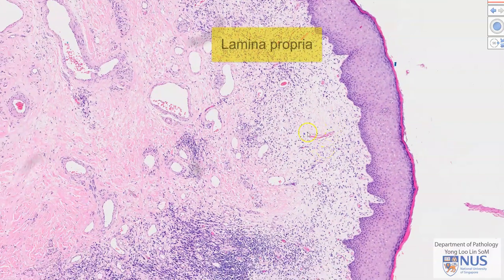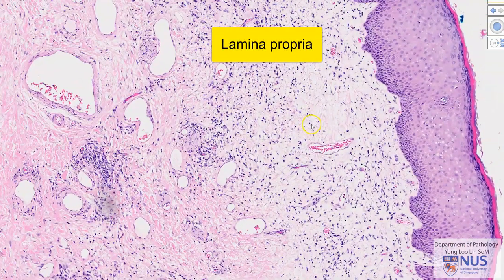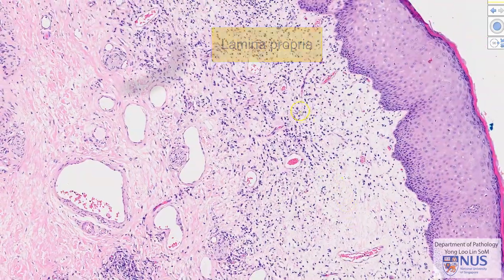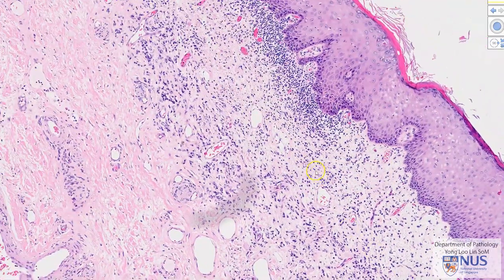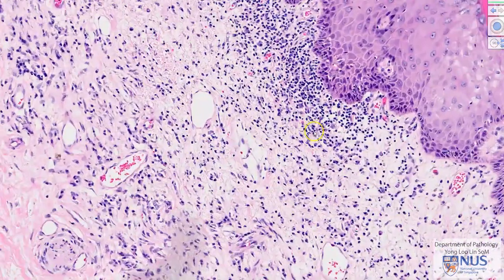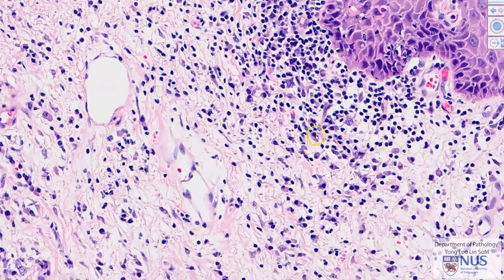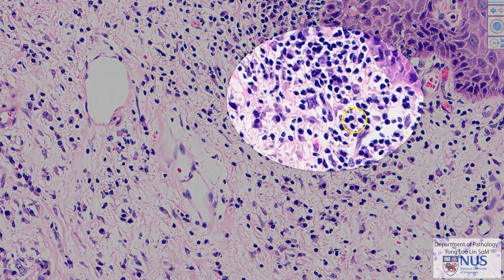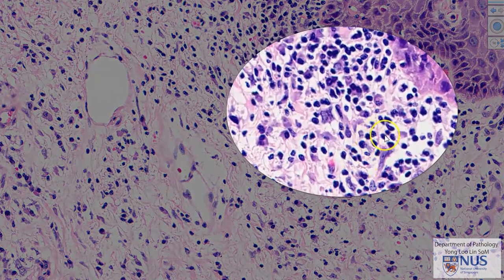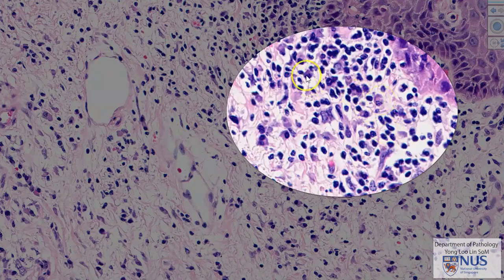Just deep to this is the lamina propria, which is composed of collagen and blood vessels. In this particular case, we can also see that there is quite a lot of chronic inflammation, which comprises many lymphocytes and some plasma cells.